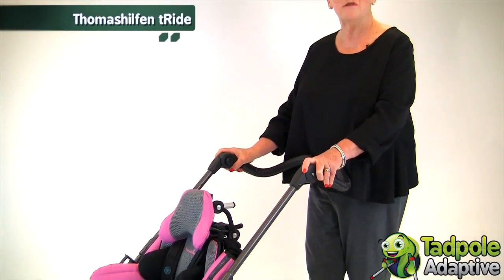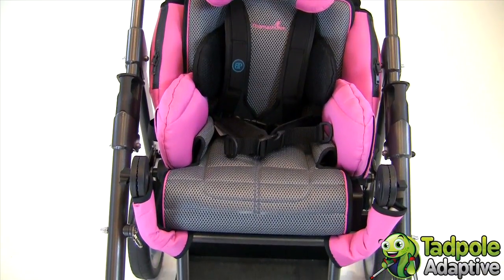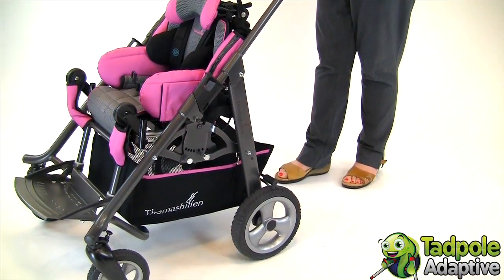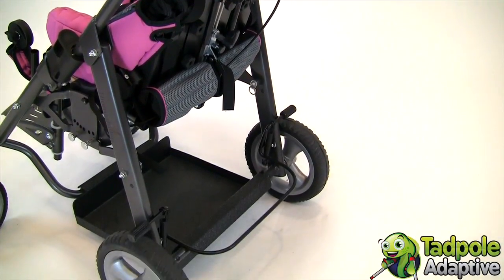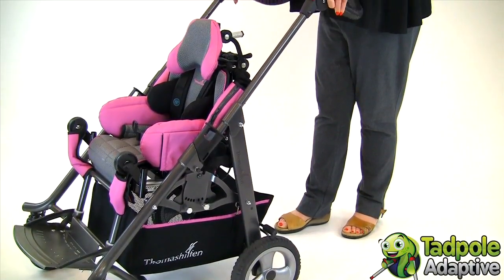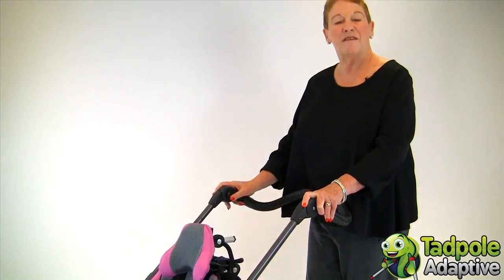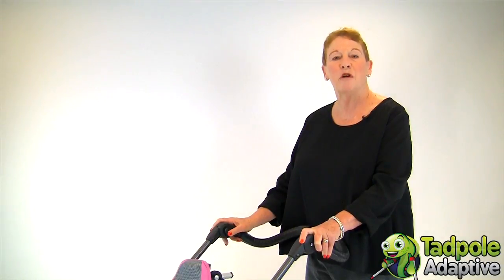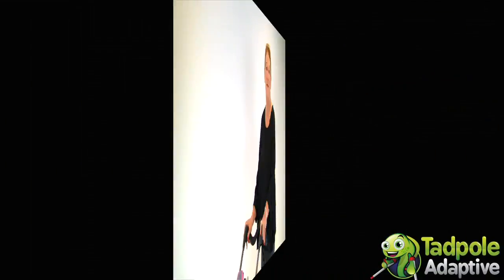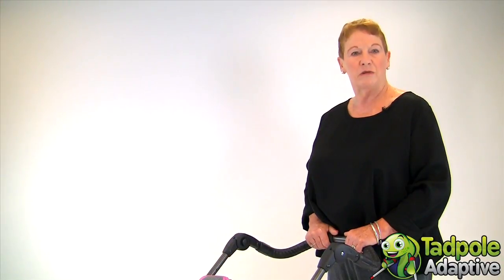I'm proud today to bring you the newest member of the Thomas Hilfen family of pediatric wheelchairs, known as the T-Ride. The T-Ride is family friendly, simple, and easy to adjust, making it able to accommodate children from moderate to complex positioning and medical needs without having the complexity of using tools for adjustment. Even the growth adjustments can be made without any tools. T-Ride is designed for use for children with moderate to complex medical and positioning needs, including those who lack head control.